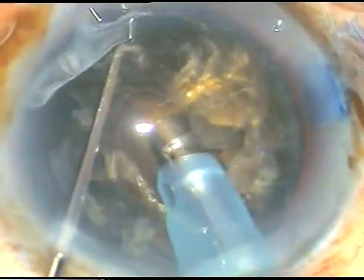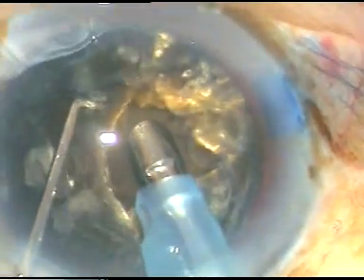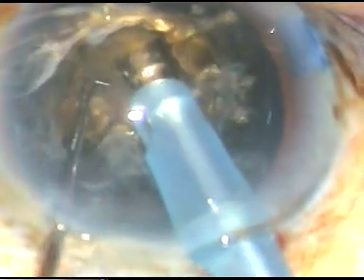And now I am in bevel-down position and I am sculpting, making a pit — making a crater at the center of this hard nucleus, that is at the anterior pole of this hard cataract. You can see that it looks like granite. I did a granite cataract a few months back and it looks almost like that — even harder than that. A pit is being made, and after I reach a certain depth I rotate the phaco tip, make its bevel up, and sculpt for some more depth.